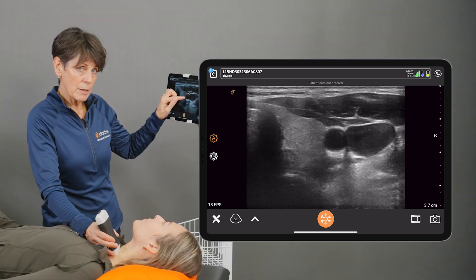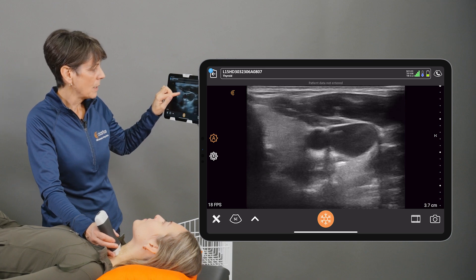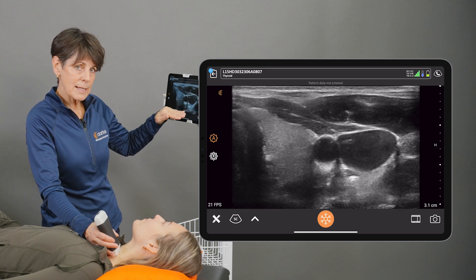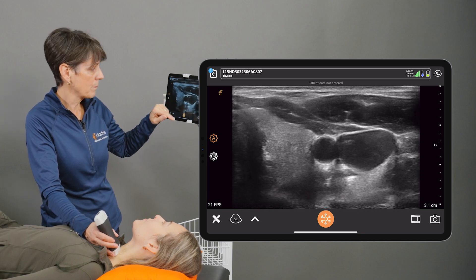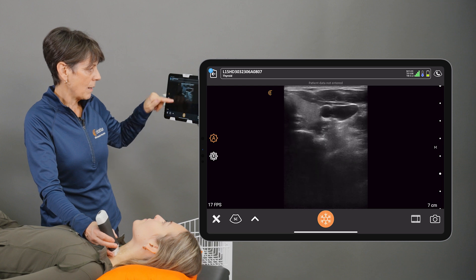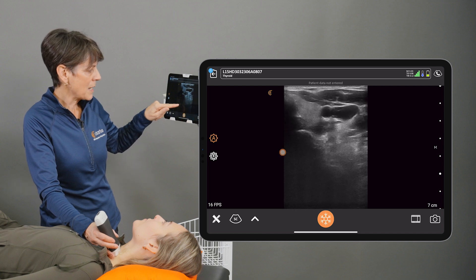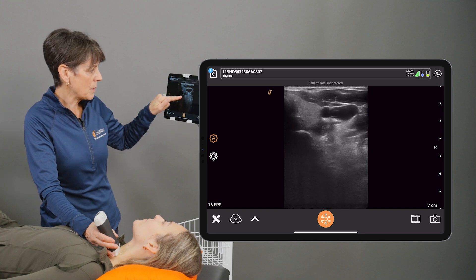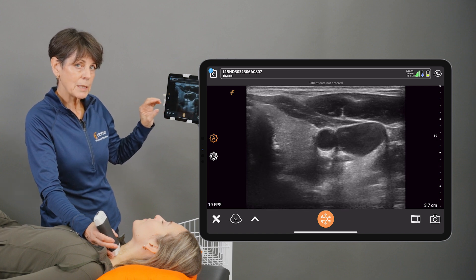I have my carotid artery here, and if I want to center it better on my image I can decrease my depth. Now I'm seeing less anatomy at the bottom of the image, but that's okay because I'm interested in the carotid artery. If my depth is too deep and I swipe up, all of a sudden my carotid artery is this tiny little structure up here — I'm scanning at seven centimeters but there really isn't any anatomy of interest at seven centimeters. So optimize your image with the area of interest centered, and that'll probably give you the best results.